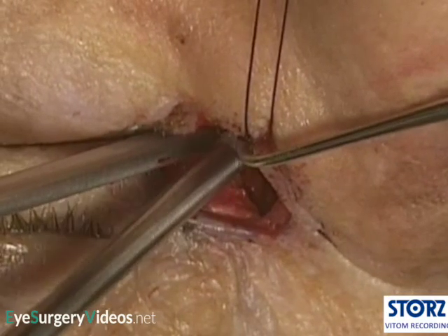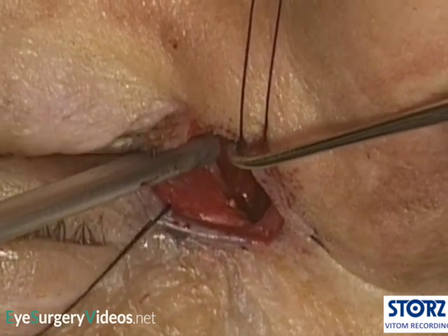The small risk of CSF leak must be considered. If the surgeon is unaware of the surgical landmarks and the location of the ostium, this could occur directly from extending the ostium too far superiorly and reaching the skull base at the roof of the ethmoid air cells or fovea ethmoidalis.